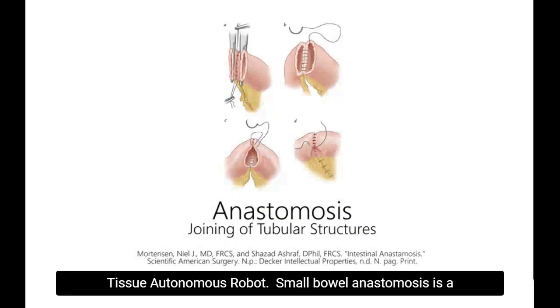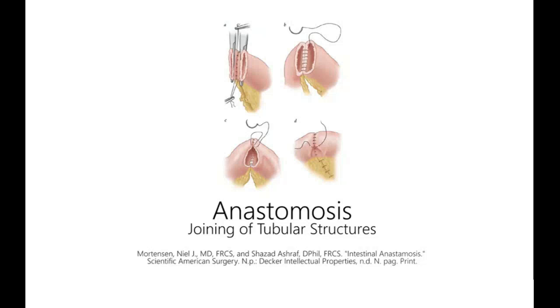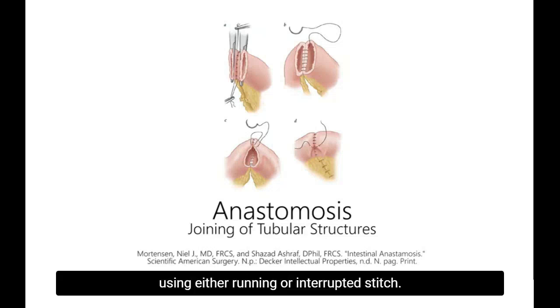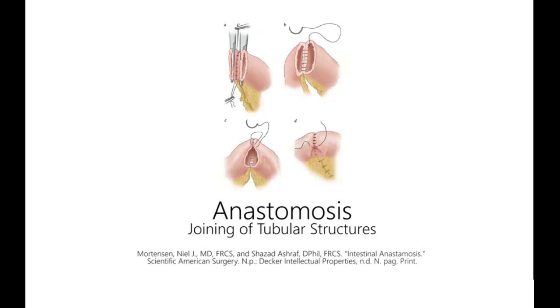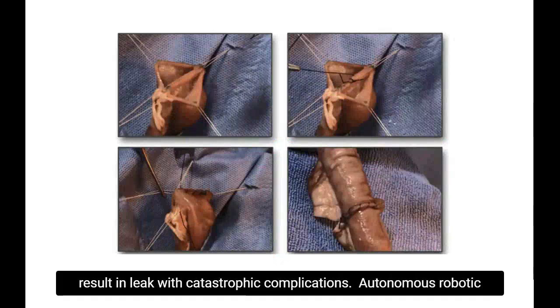Small bowel anastomosis is a procedure performed over a million times each year using manual, laparoscopic, or robotic techniques. During this task, the surgeon stages and reconnects two loops of bowel by suturing adjacent tissues using either running or interrupted stitch. Consistency of these stitches is critical for successful anastomosis, as even a single missed stitch can result in leak with catastrophic complications.